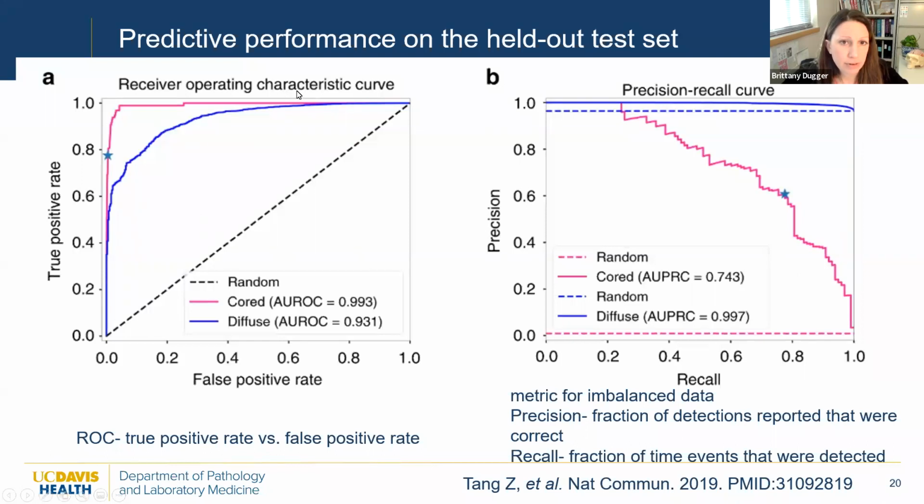And so we have the receiver operating characteristic, and to remind, because I know it can be early for some people, the receiver operating is basically true positive versus false positive rate. And you have this trade-off of which way you're going to go. You're pretty much never going to get it 100%, but how close can you get?